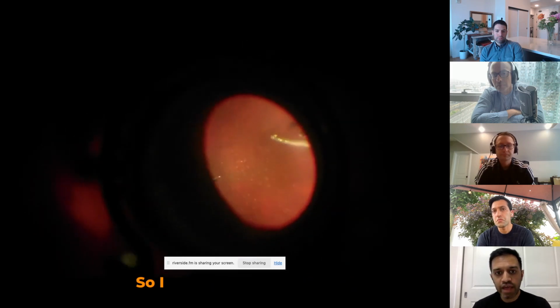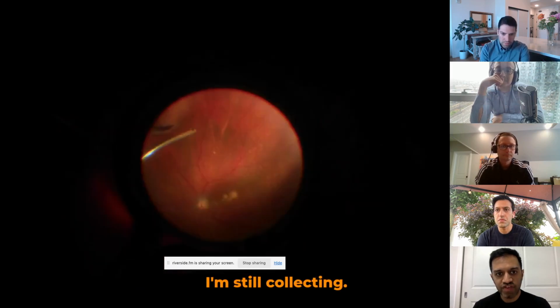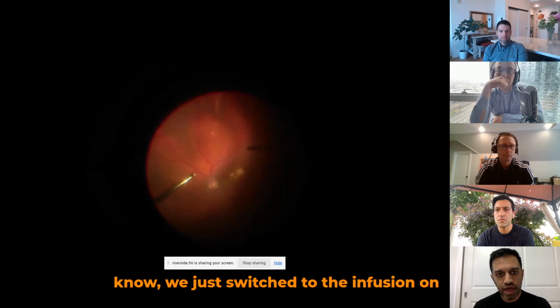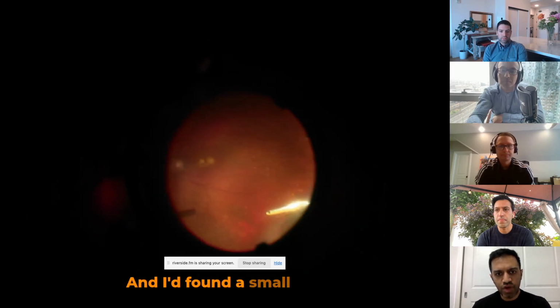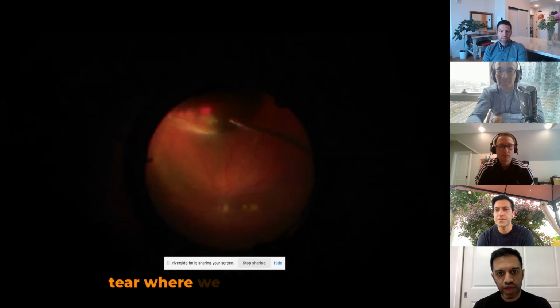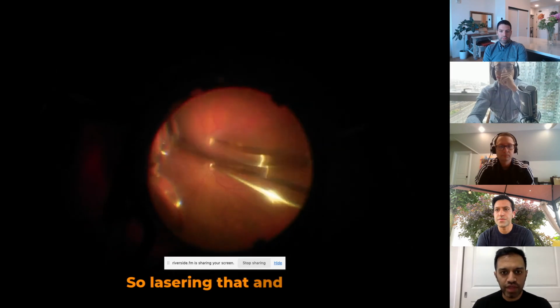So here, just doing some peripheral vitrectomy, and all of this I'm still collecting sample. And then once we do that, we switch to the infusion on and do a depressed shave 360. And I found a small area of suspicion where I thought maybe a small tear where we had elevated hyaloid. So lasering that and then just going to air.